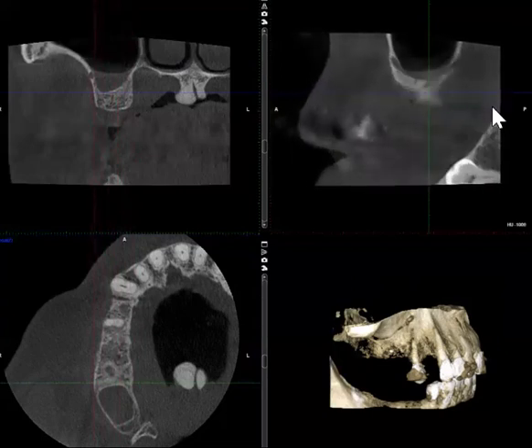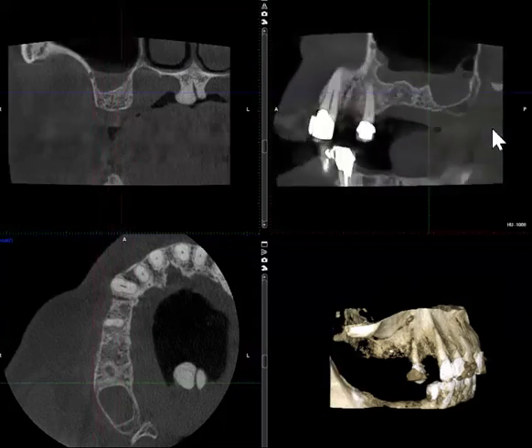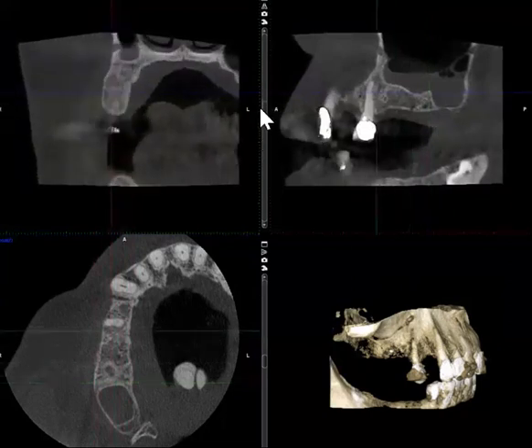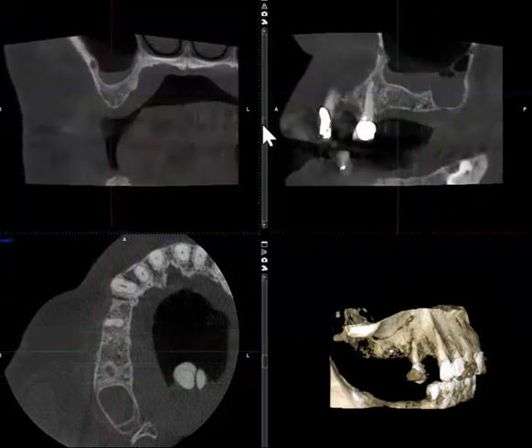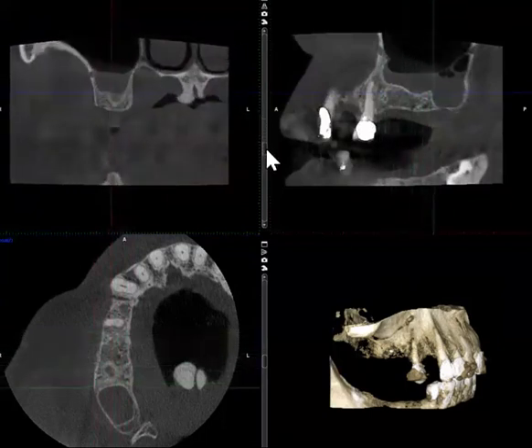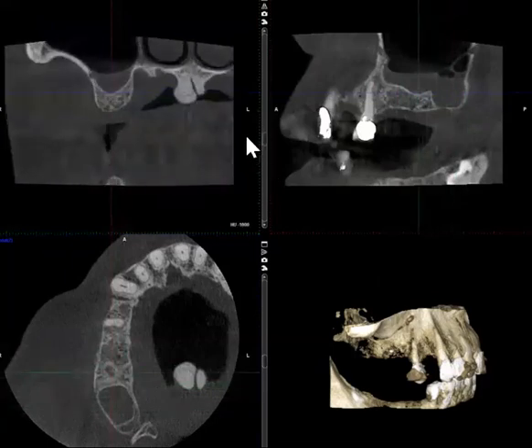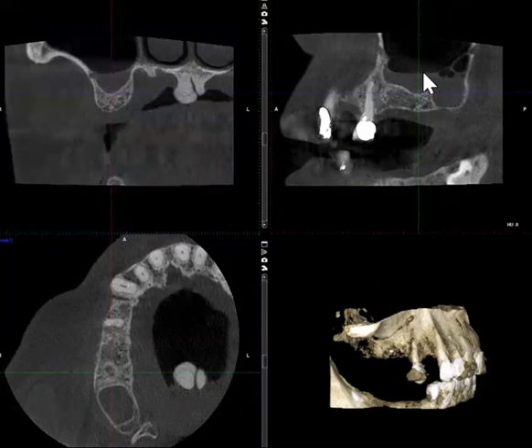We can start from the anterior aspect of this opacification and move posteriorly. This example is what's called an air-fluid level, and when you see this, it is very strong radiographic evidence for acute sinusitis.